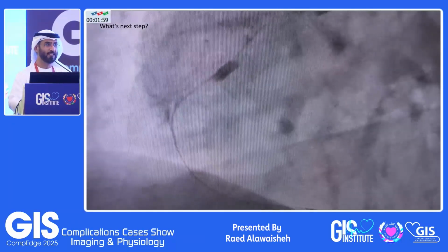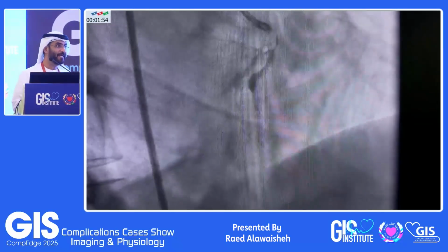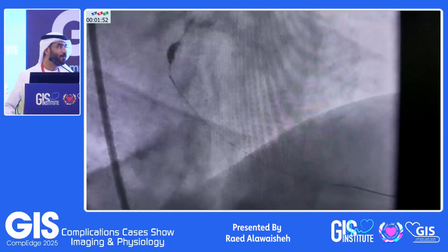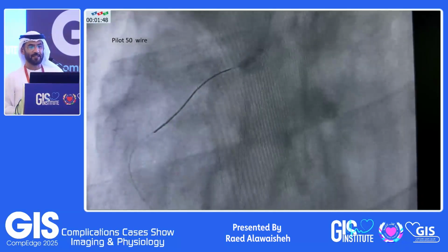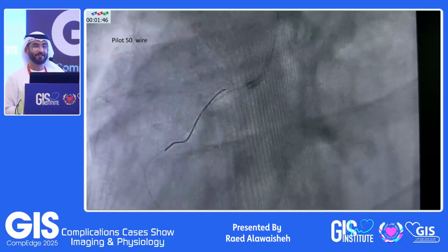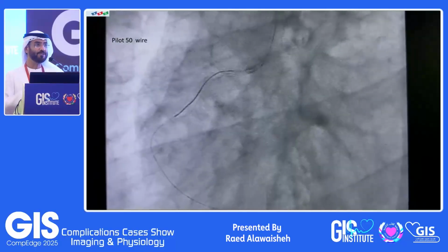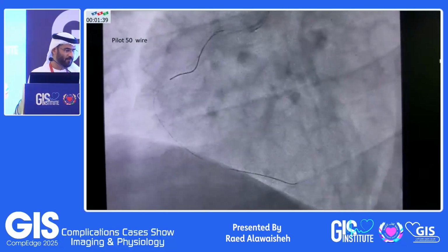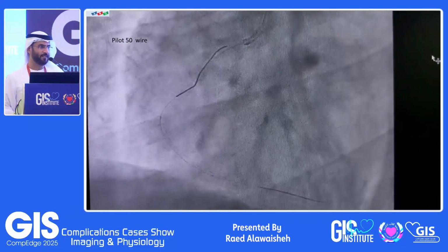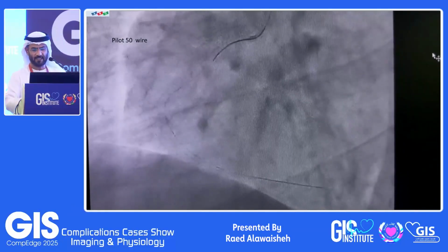Okay, next, you know what he did next? Unexpected. He took another view. This is really what to do: take another view and make sure wires are okay, everything's fine, in place. Then it will tell you what to do next. Okay, he took another wire, which is a Pilot 50. Because he thought that the wire was in, but when he took the other view, we discovered that we are not in the lumen. So let's take the other view and take another pathway.